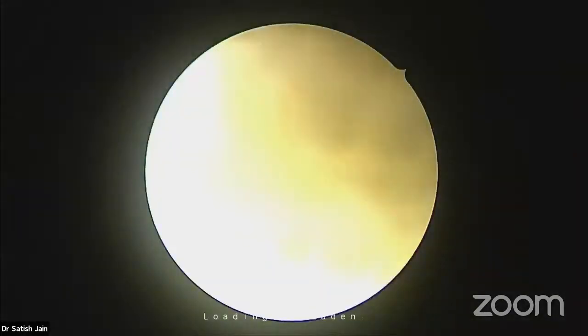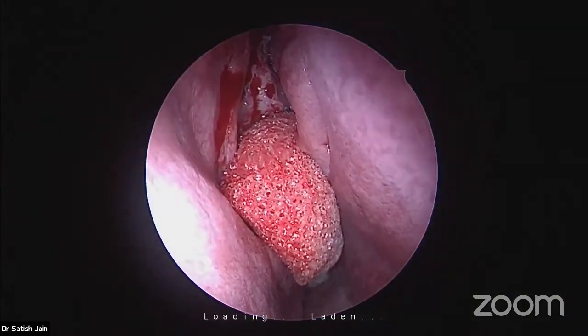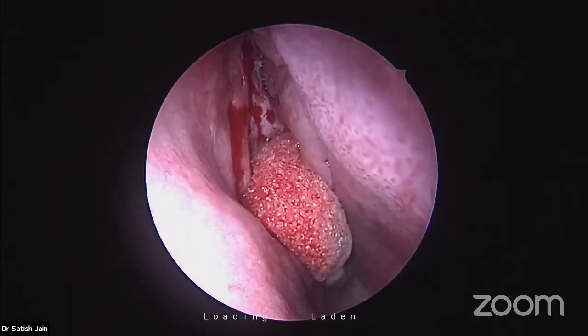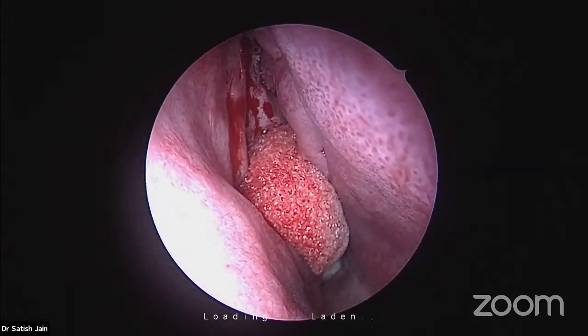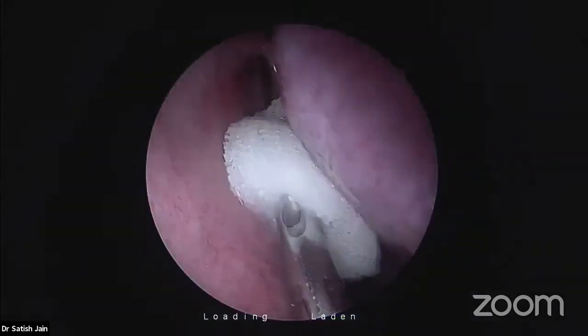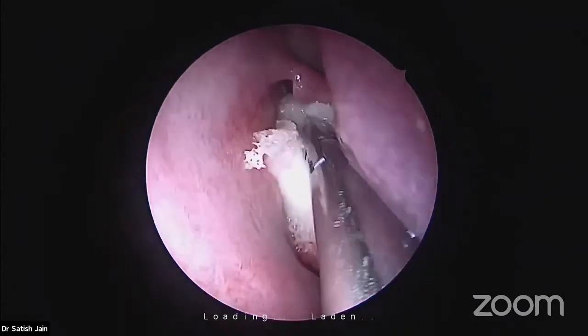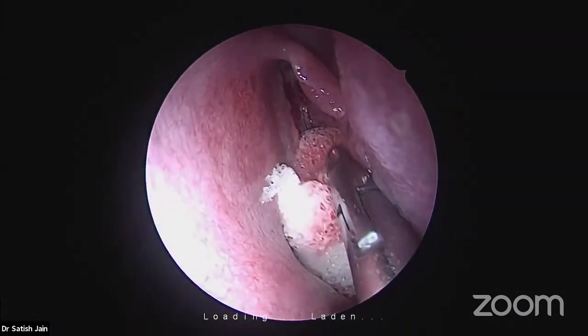Do you have a plan for antrostomy size disease-wise, or is it somewhat uniform? That's a very important question from Dr. Kranti. See, first of all, why does this question arise? What is relevant to the size of the antrostomy?